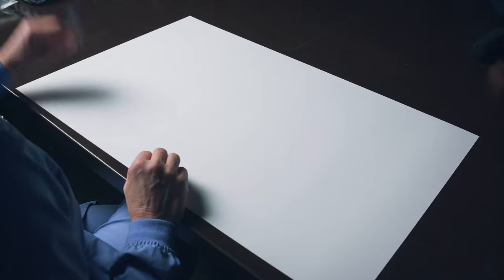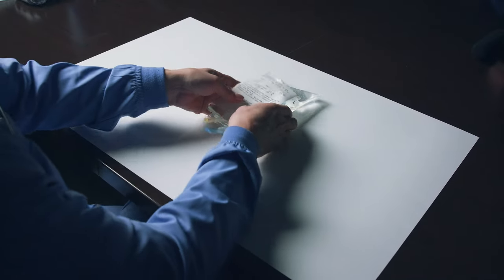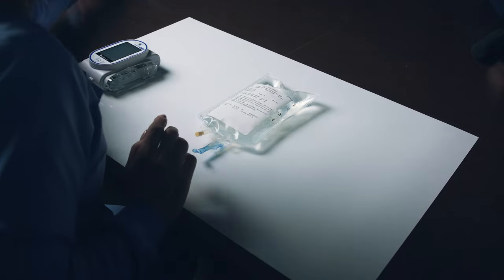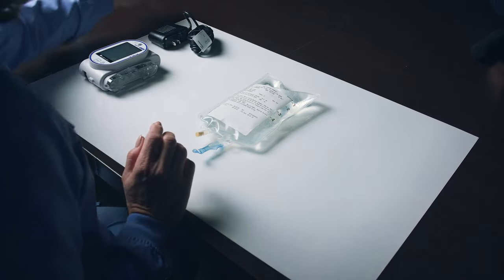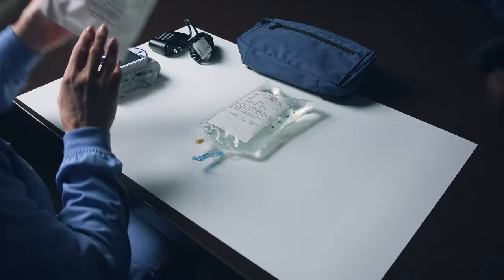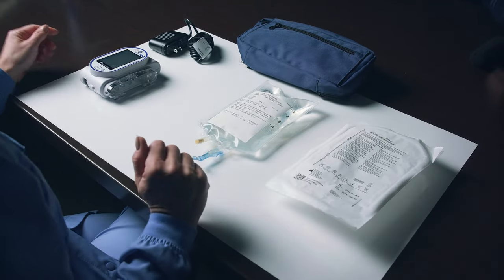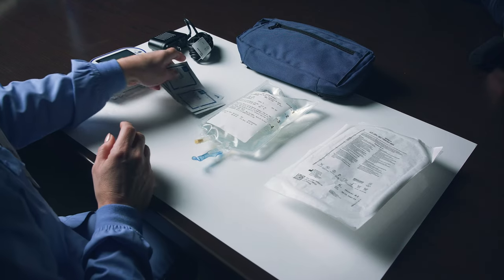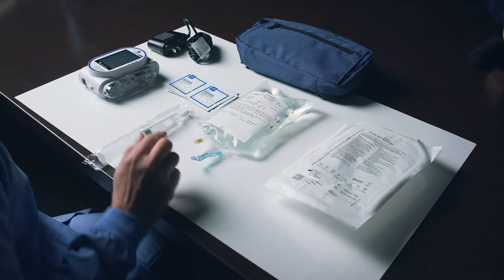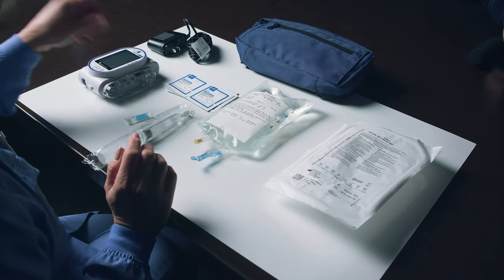Gather your IV therapy supplies. These should include your bag of medication, Sapphire pump, charging cord, pouch or large backpack, IV tubing administration set, antiseptic wipes, one saline syringe, and one light blue sterile cap if the same tubing will be used for your next dose.